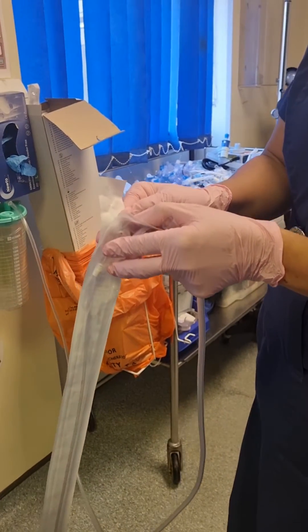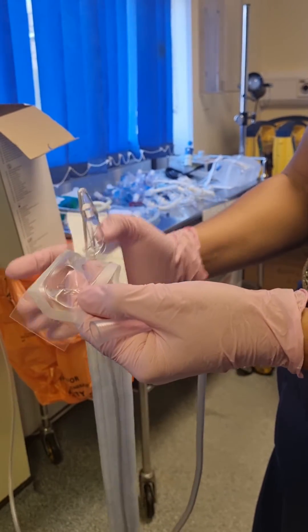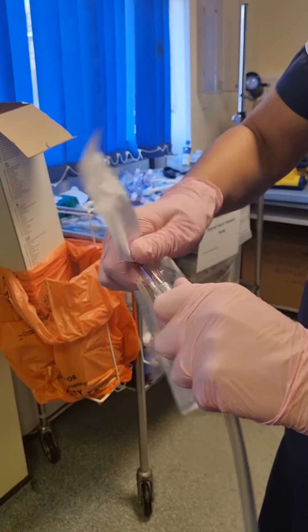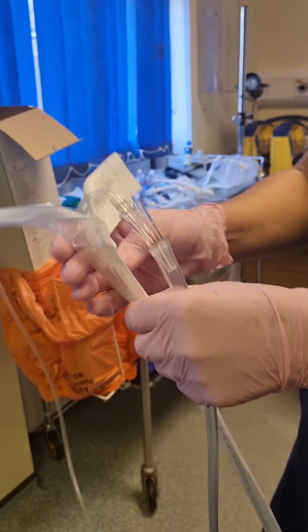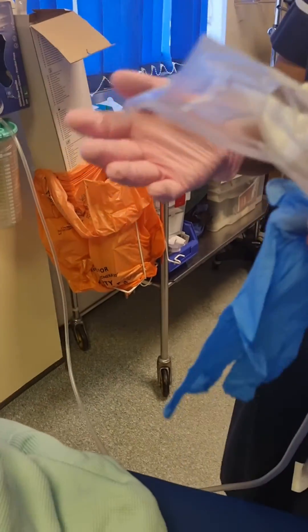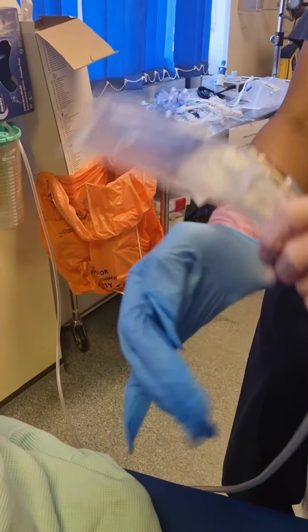To set up, attach your suction catheter prior to getting ready to perform suction. Use double gloving so that you are always protecting yourself and your patient from any infection risk.